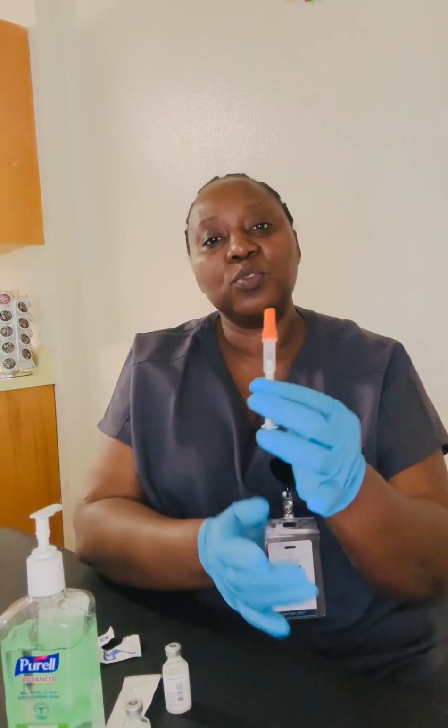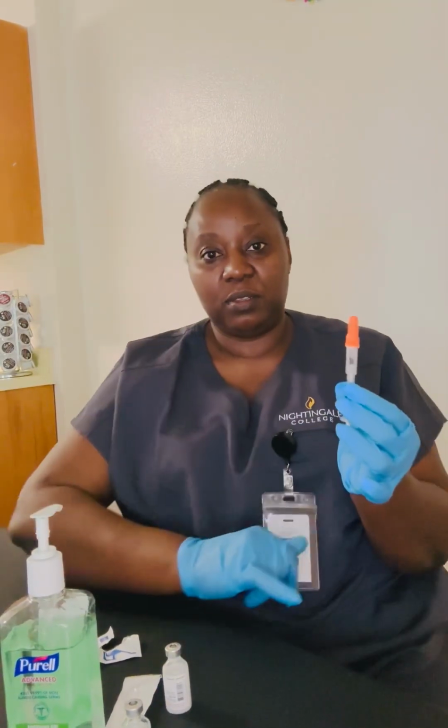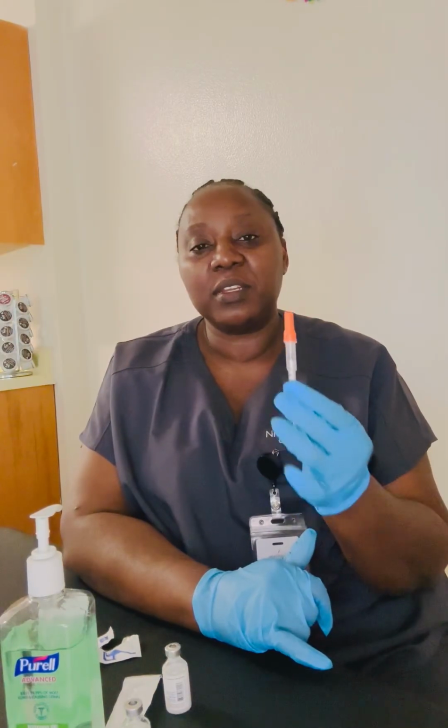Okay. Once that is done, we'll do our final verification to make sure we have the right medication. Go back to the EHR MAR, compare, and make sure we have a total of 12 units, which is 4 units regular, 8 units NPH, to have a total of 12 units. Because the patient is not with me, I'm going to label this already filled syringe with the patient's name and the dosage, and then I can go to the patient's room for administration.